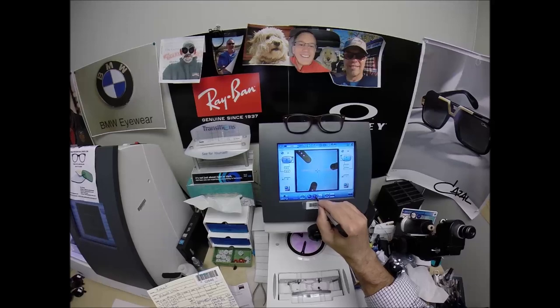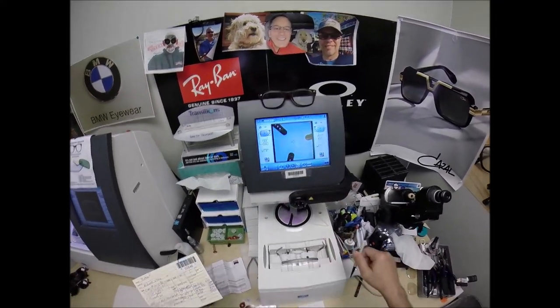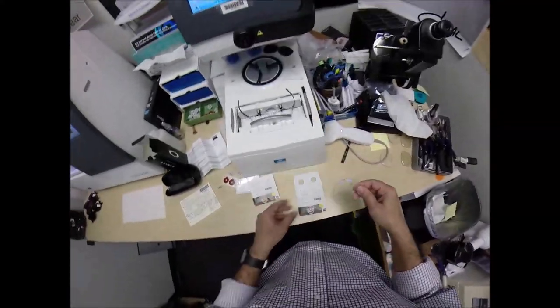I'm going to raise the optical center up to 24, change the layout screen from single vision to progressive, because Robert got that 40-year virus, as I call it. Don't worry, I got the virus too. Come on in, the water's fine.